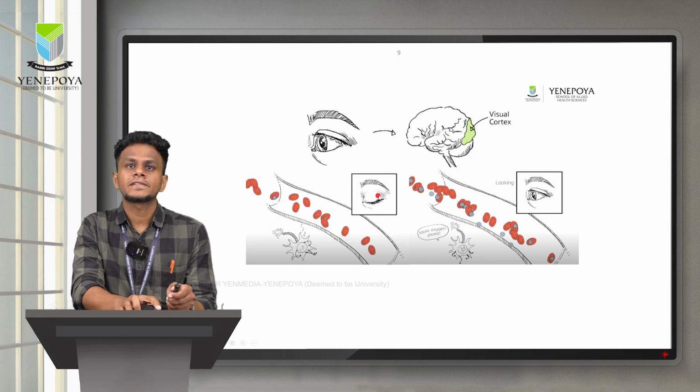If the patient is not seeing, if the eyes are closed, what is going to happen? In the corresponding area, this occipital cortex, the blood vessels will be very normal. It will have oxygenated hemoglobin flowing through the arteries, the blood vessels. The neurons corresponding to that particular area will be completely at rest, because the eyes are not seeing anything, so the neurons will not be active.